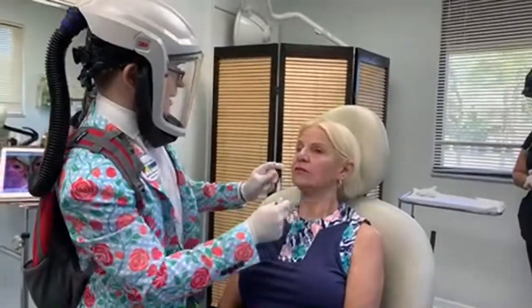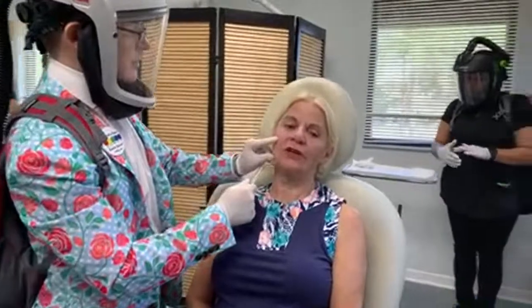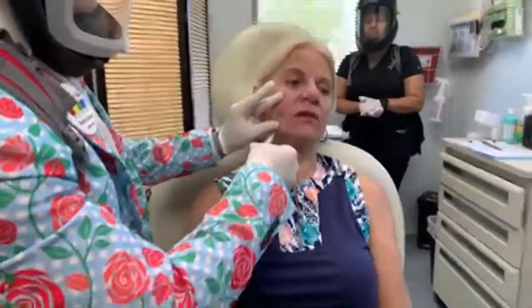So a little bit of swelling, I like what I see. I'm going to turn now. I'm just going to even build with a little. With injections, I've never had numbing like you do. Yeah, we have our technique. Feel a little pressure pinch. I didn't feel that. Feel a little pinch in there. Now I feel it. And it's going to numb. How about here, a little pinch? So now I'm focusing on deep to build up that volume and re-inflate. And I still use the shiver technique because the goal is you want a small amount of filler over a large area. That's the outcome.